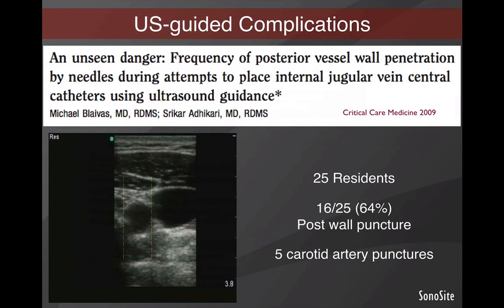And so I think when you look at some of the problems that we have, we tell people, well, with ultrasound guidance for central venous cannulation, you have a very low rate of arterial puncture. And we see, in a nice study done by Dr. Blavis, that when we watch our residents who are less experienced do this, they actually have problems. It's a nice ultrasound evaluation where they visualized the residents doing ultrasound guidance on task trainers and showed that they actually puncture the wall 64% of the time.